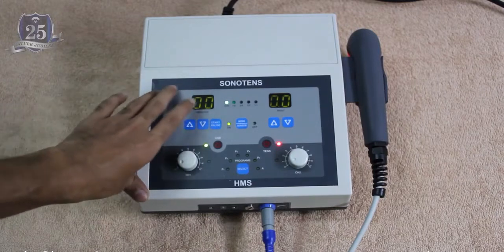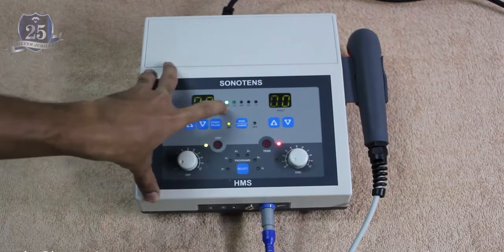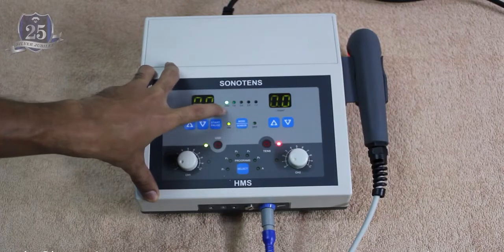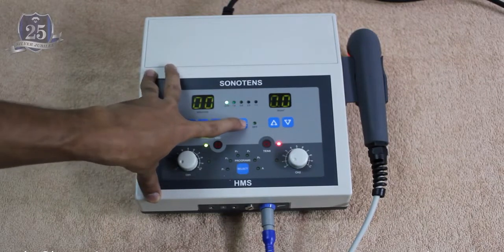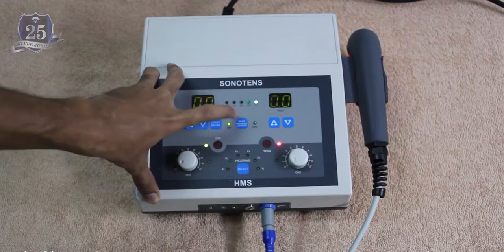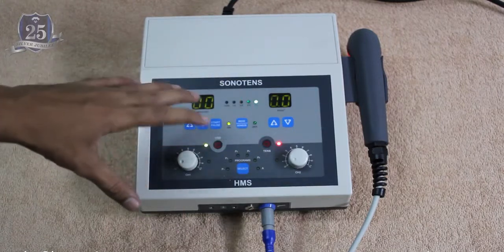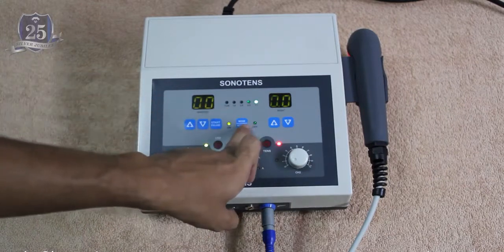So this is the basic setup for ultrasound. It's similar to the endosonic model. So these are the different modes which are offered with this ultrasound, same like the endosonic. So the first one is continuous, the second one is 1:9, third one is 2:8, fourth one is 2:3, and the fifth one is 1:1. So these are the different types of modes, same like endosonic. It's offered with this machine too, and you also have all the features from the endosonic, including the auto sensing feature, which can be turned off.